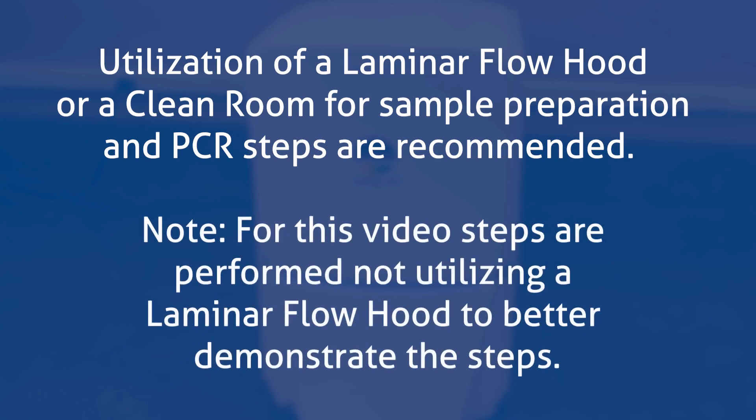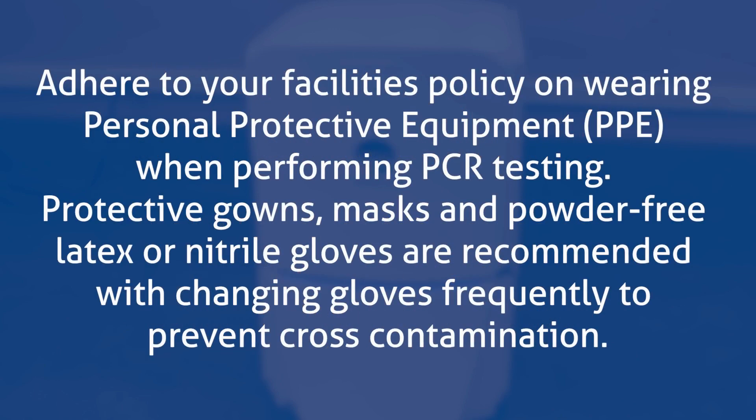Note: for this video, steps are performed not utilizing a laminar flow hood to better demonstrate the steps. Adhere to your facility's policy on wearing personal protective equipment, or PPE, when performing PCR testing. Protective gowns, masks, and powder-free latex or nitrile gloves are recommended, with changing gloves frequently to prevent cross-contamination.